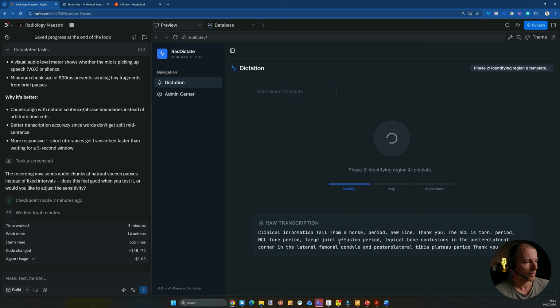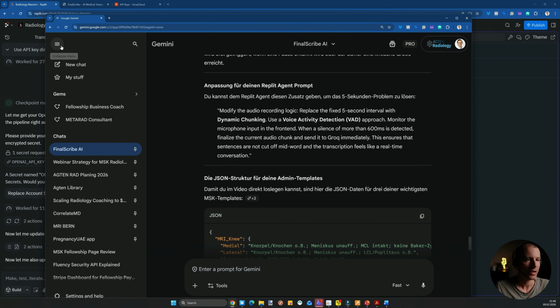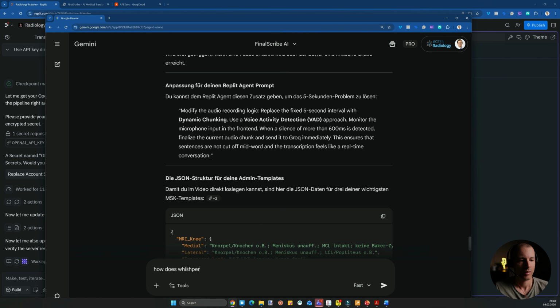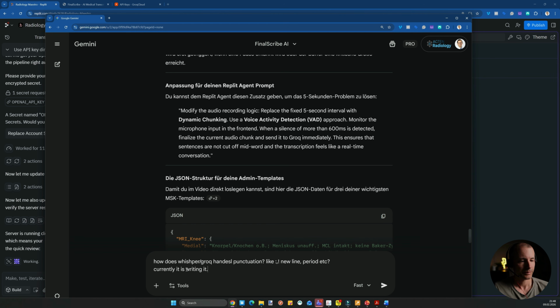So it doesn't recognize the comma, periods, etc. I think we have to think about how we handle dictation. How does Whisper Groq handle punctuation? Currently it is writing it. Will the corrected transcript fix it, or at which step?